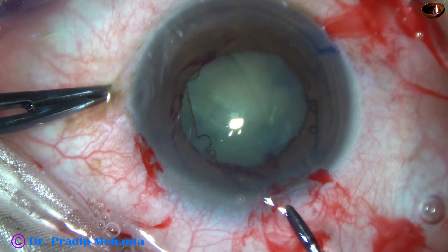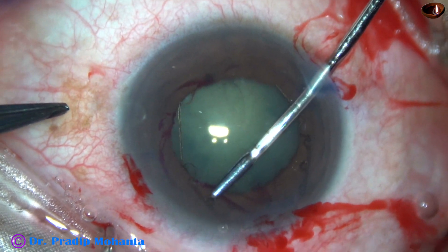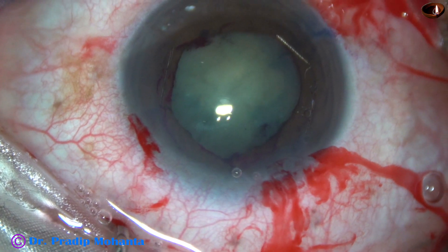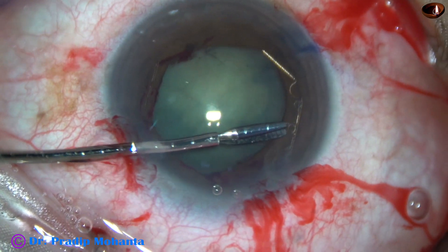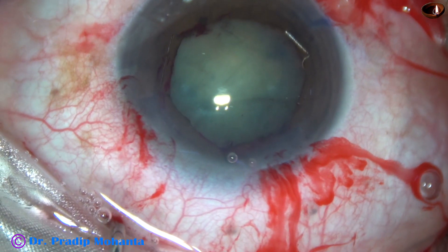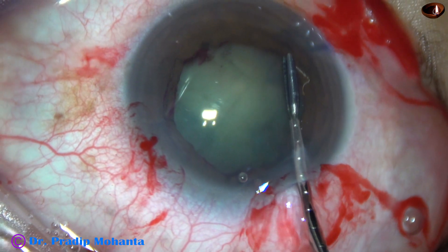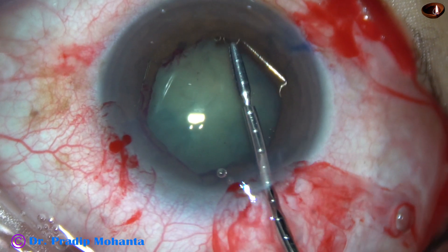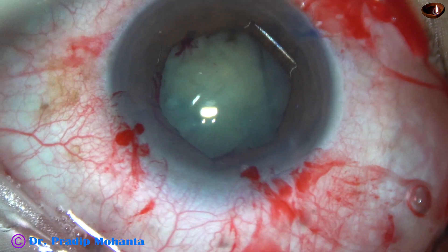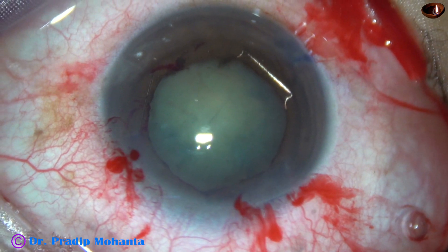I tried to push it, but it didn't go in. Go through the right side port, hold the middle tab, pull it inside, and then tuck this flange at 1 o'clock. Then go through the left side port and tuck the flange at 10 o'clock. By this time, the flange at 7 o'clock, which was above the iris, part of it has gone behind the iris, so we have to tuck it properly. And it is done. Now the pupil has taken a beautiful hexagonal shape.